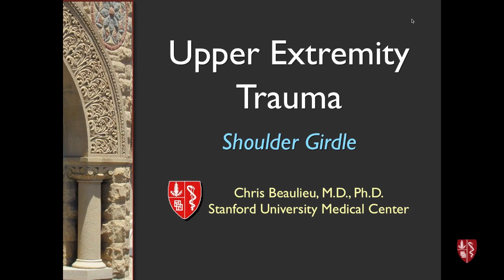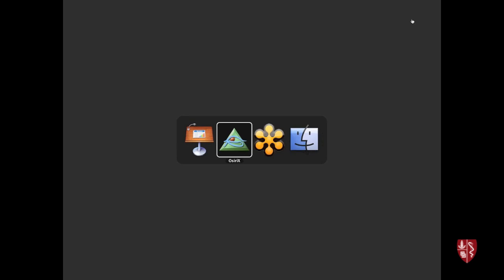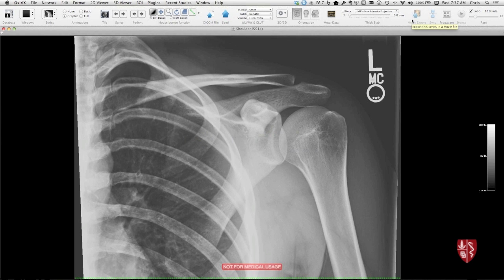So the first part's on the shoulder girdle. And what I'll do is show them interactively on OsiriX here. So first I just wanted to review normal shoulder anatomy real quickly.